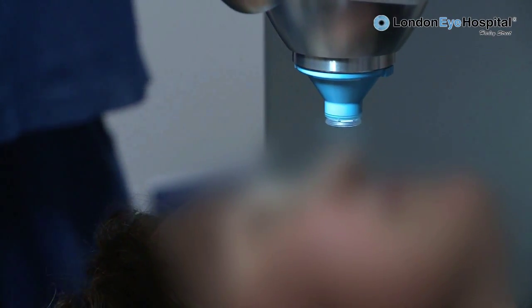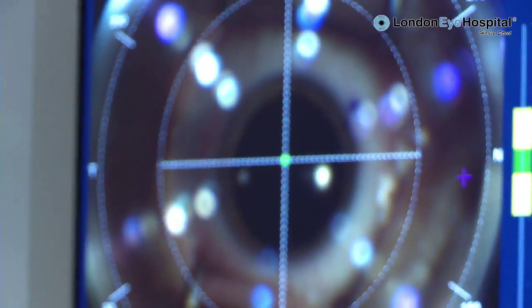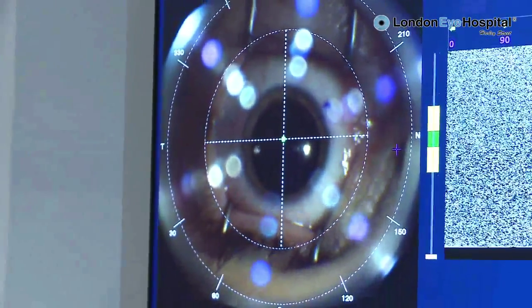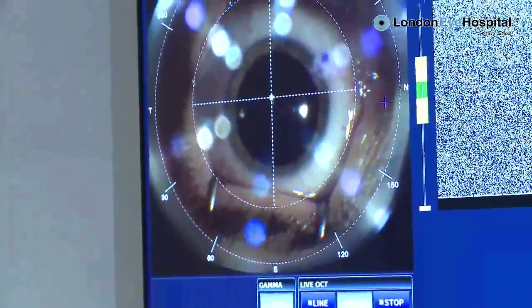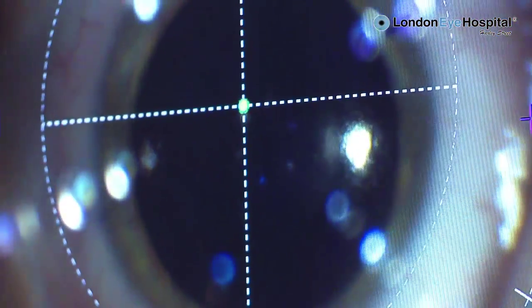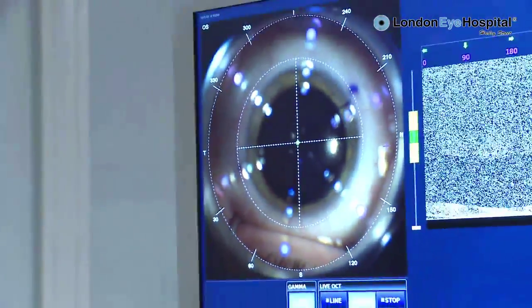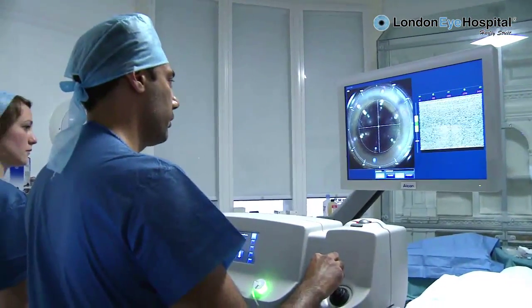In a moment I'll give you a target to look at. Chin up a little bit — you just want your eye to be horizontal. In a minute you'll have a circle of lights to look at. You just look at the centre of those circle of lights. Sometimes there's a red flashing light in the centre. It's going to come very close to the eye, so the contact lens comes and just sits on the front of the eye.